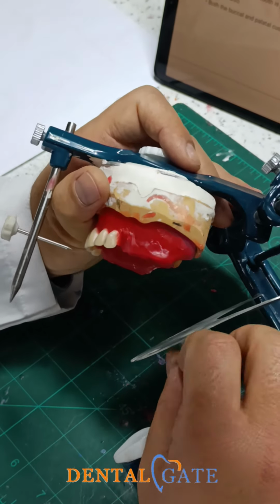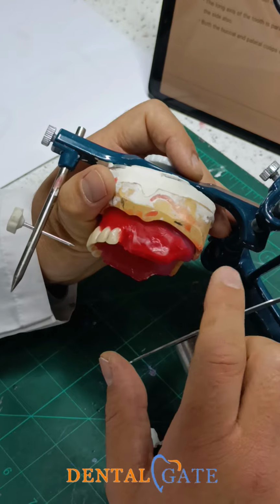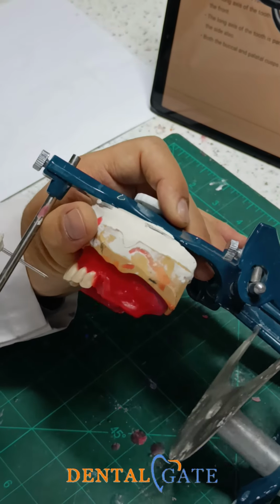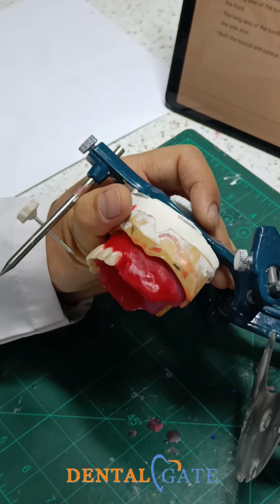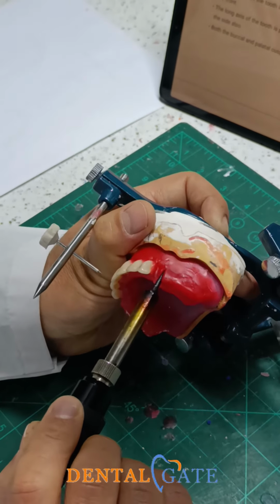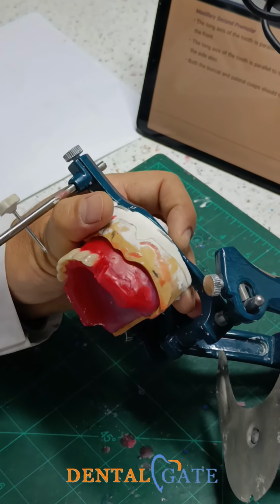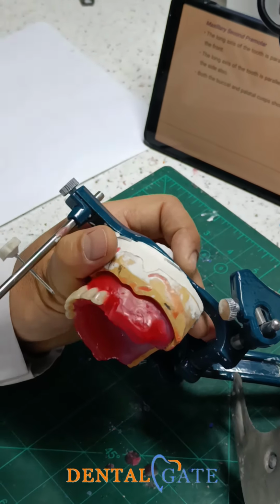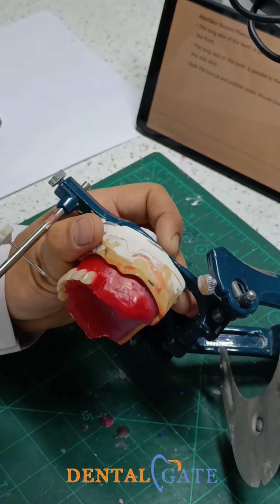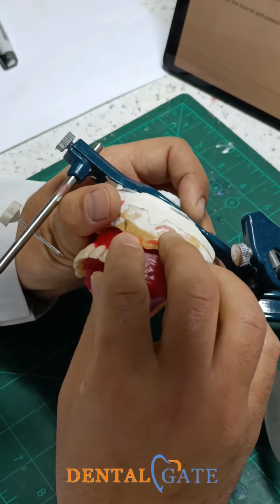We will make a curve from the canine to the premolars. Regarding the lower, from the cusp of the anterior teeth to reach the retromolar pad. It will pass through the first edge of the retromolar pad. So this curve will be performed very naturally when the patient makes a movement of his mandible.